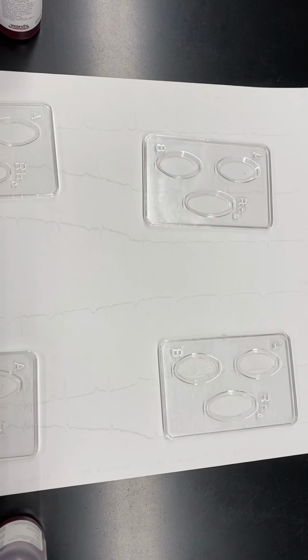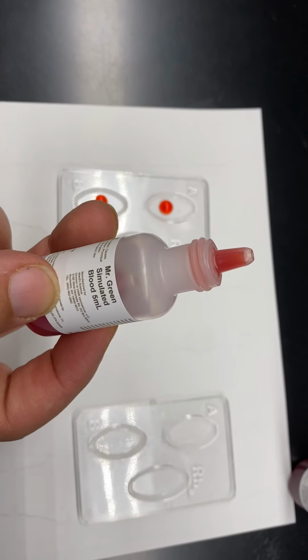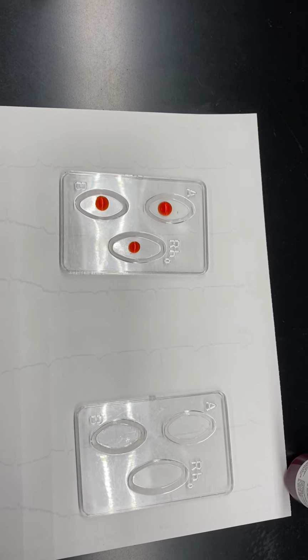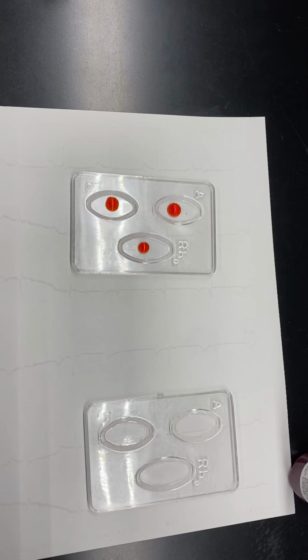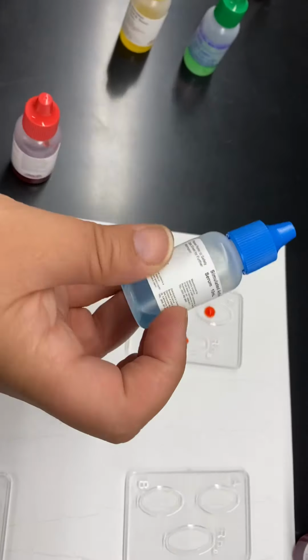So I'm gonna add a couple drops of blood sample to one tray. Notice they're all from Mr. Green. To the one that has the label A, I'm going to add the serum anti-A. Again, I'm gonna add a couple of drops to that.